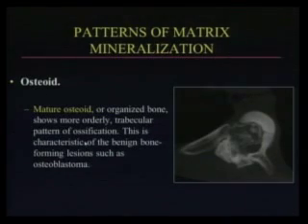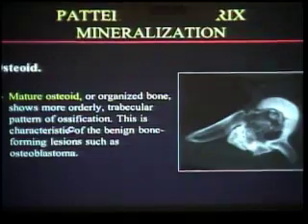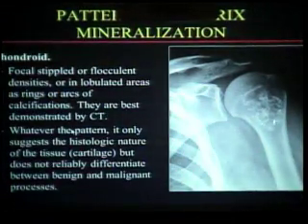And this is an osteoblastoma. See, this is very similar to bone. Look at the transverse process. This is well-organized bone, so this is mature osteoid matrix. And this is chondroid matrix in an enchondroma, and you see arcs and rings, right? This is the typical description.